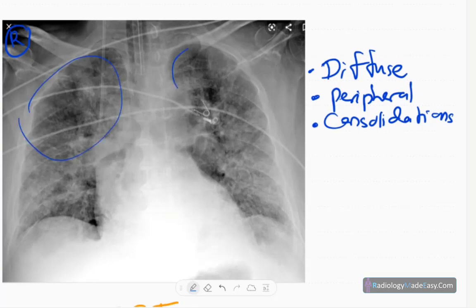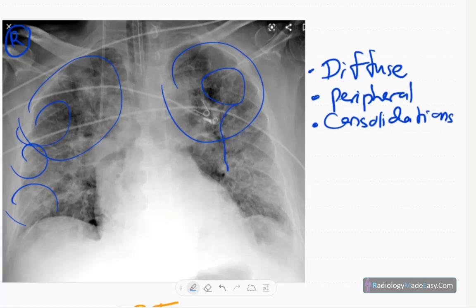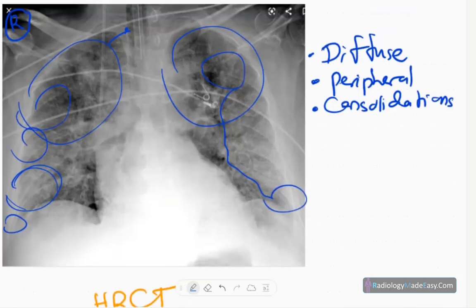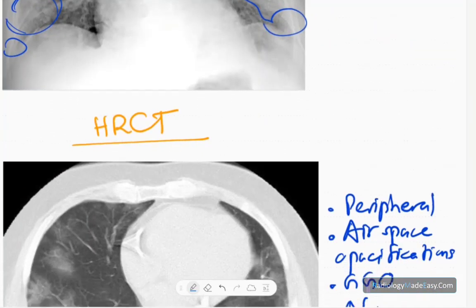When patients become severely ill, there will be diffuse peripheral consolidations involving the upper lobes as well, with multiple consolidated areas throughout the lungs. Almost the entire lungs are involved at this stage with no pleural effusions. Ground glass opacification becomes consolidation peripherally with air bronchogram formation, and upper lobe involvement increases in later stages compared to bi-basal involvement in early stages.